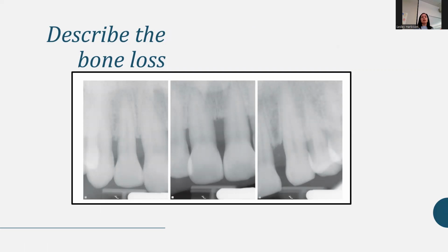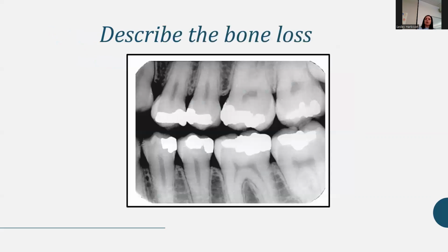So I'm going to just fly through these. There's answers in the notes that you can see, but because we're pretty much out of time, I'll do those worksheets and I'll post the key. Just try and look at these worksheets and compare them to the schematics in the PowerPoint. I do think you'll be able to, for the most part, answer these, and then I'll just post the keys this week. But these are just examples for you to describe the bone loss.